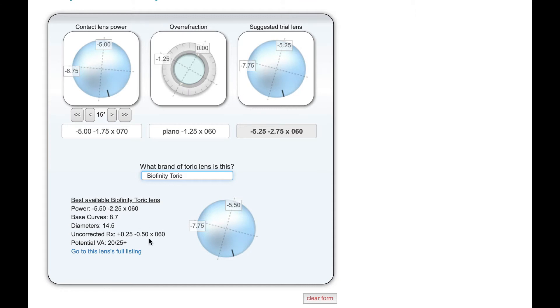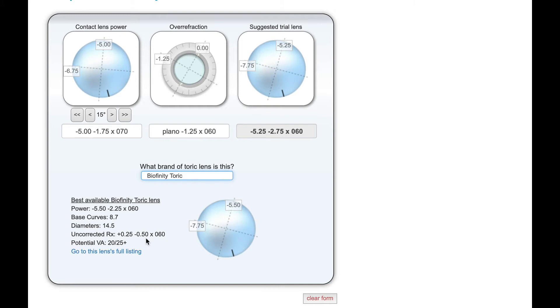And it tells us that we're correcting most of our patient's prescription, but there'll be a half diopter of uncorrected astigmatism because of the changes it made. The spherical equivalent will be zero. And it's still saying that with a half diopter of uncorrected astigmatism, we should still have the potential vision of 20/25. So hopefully this lens might still be a good choice, even though it's under-correcting the cyl a little bit.